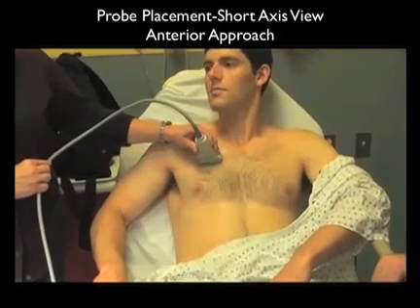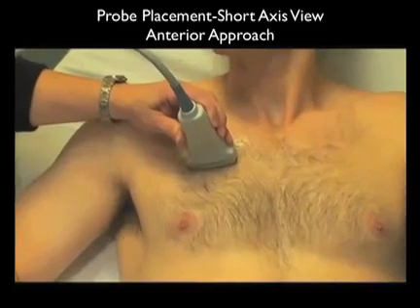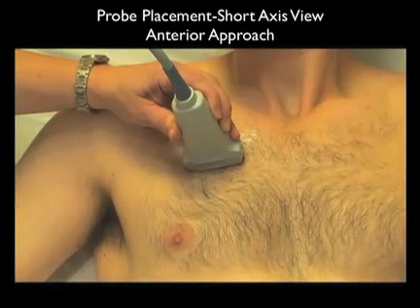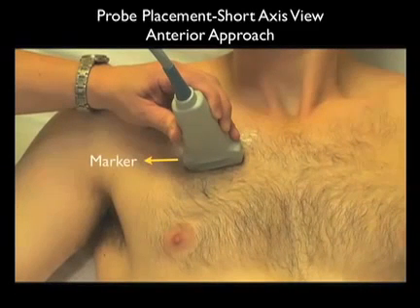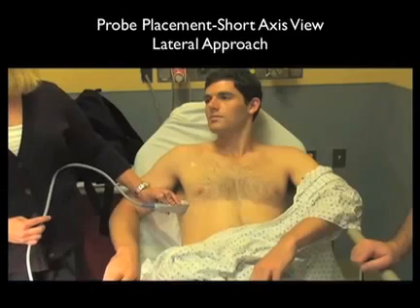Here we have the probe oriented in a transverse or short axis orientation between the ribs, looking directly down at the pleura. Notice in this case, the marker dot is located towards the lateral aspect of the patient. Using both long and short axis configurations will allow you to detect a pneumothorax with a high degree of accuracy.